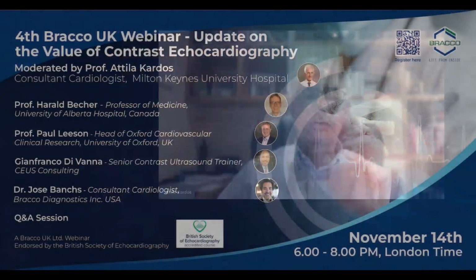Thanks very much, Harald, for this insightful analysis of wall motions and the benefit of ultrasound enhancing agents in detecting and accurately describing wall motion and wall motion thickening. So I would suggest that we save the questions for the end of the lectures, and then we have joint discussions about all the talks.